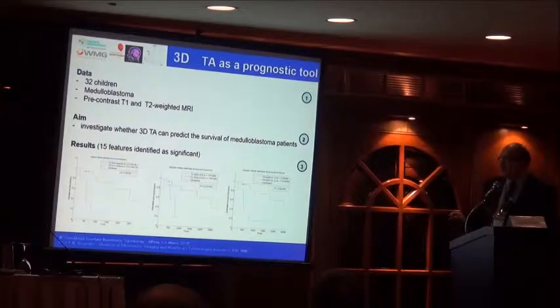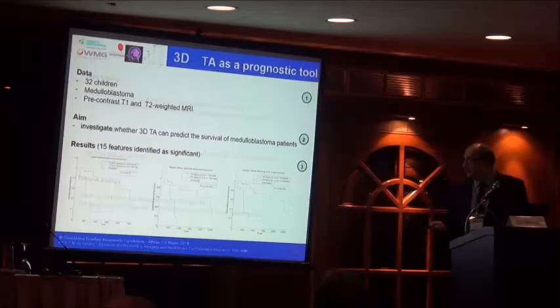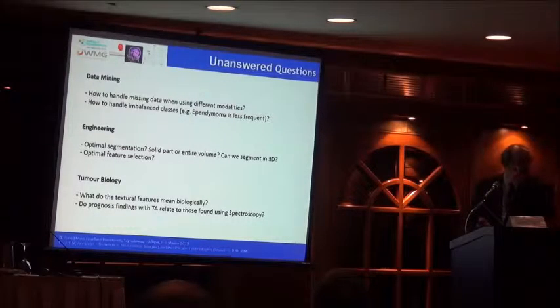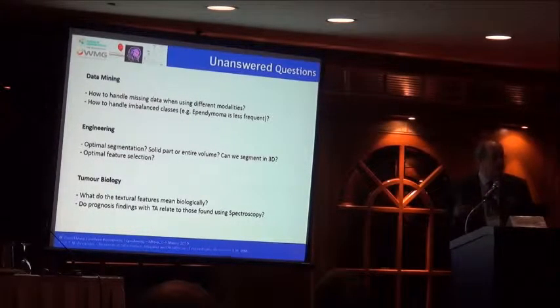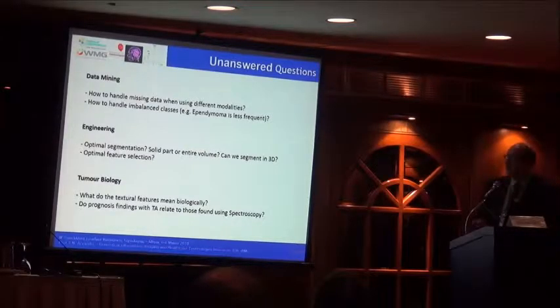This was shown in particular in features of T1 and T2 imaging. So texture analysis can tell us about survivability and prognosis, so we can plan the treatments better. An interesting approach. We can characterize tumors, we can diagnose them, we can tell something about prognosis, we can learn about how people respond to treatment. However, there are some interesting unanswered questions.